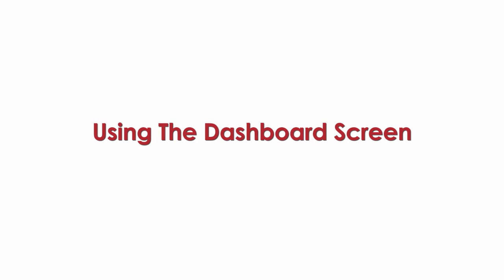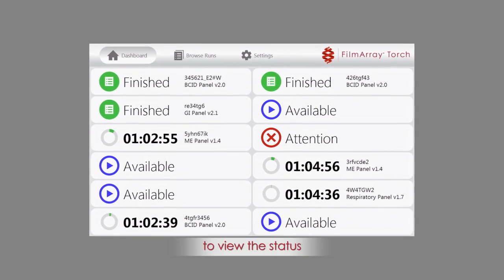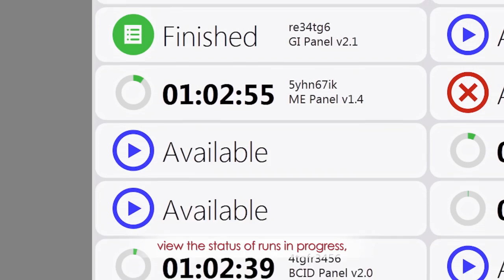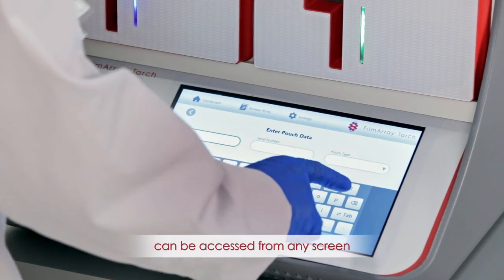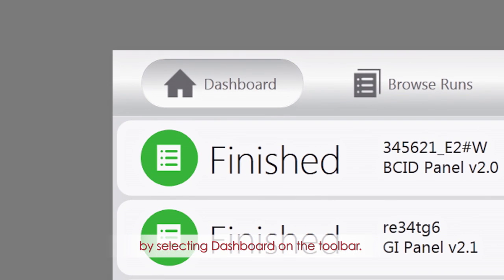Using the dashboard screen. The dashboard screen enables you to view the status of each FilmArray Torch module, view the status of runs in progress, and start a run. The dashboard screen can be accessed from any screen by selecting Dashboard on the toolbar. Browse Runs screen.